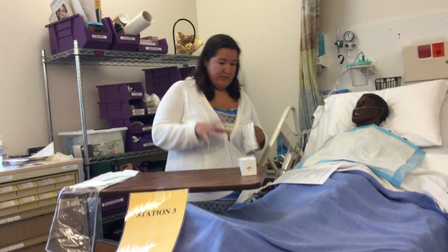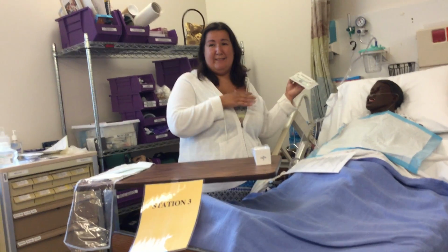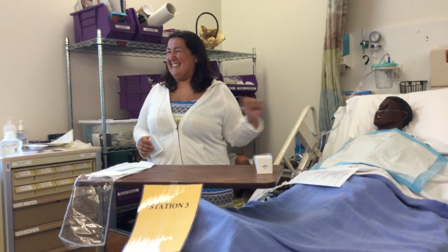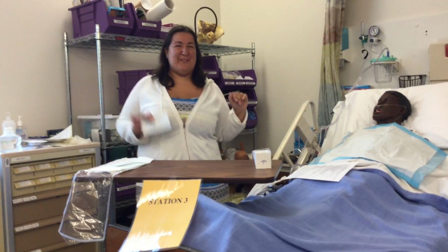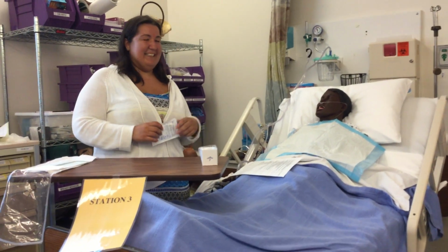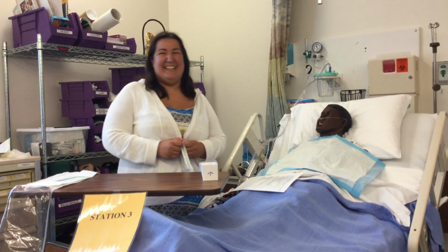So now I've got saline in there. Don't put saline in the mannequins, because they will get all sorts of gross stuff. We were doing NG tubes, and we put an NG tube in, and all this stuff came out of the NG tube. The students were like, wow, you make it look real. Then we figured out it was moldy water because we started smelling it. These are mannequins, so whatever you put in there will stay in there and get moldy and gross. For now, let's just pretend with the water and not put it into the mannequin. There's only really one hole, so it doesn't go into the lungs. If you start putting stuff in there, it all goes into a little mannequin belly, and then it starts to grow old.